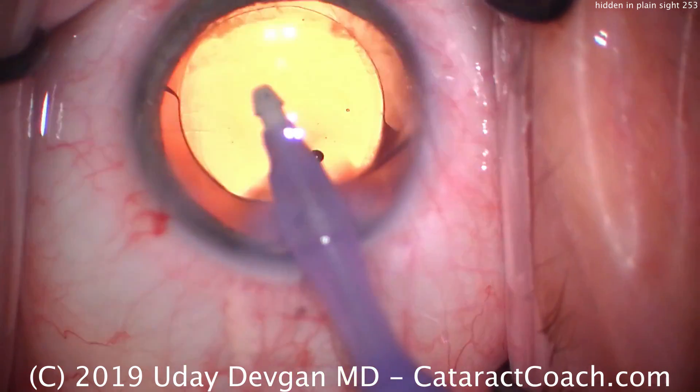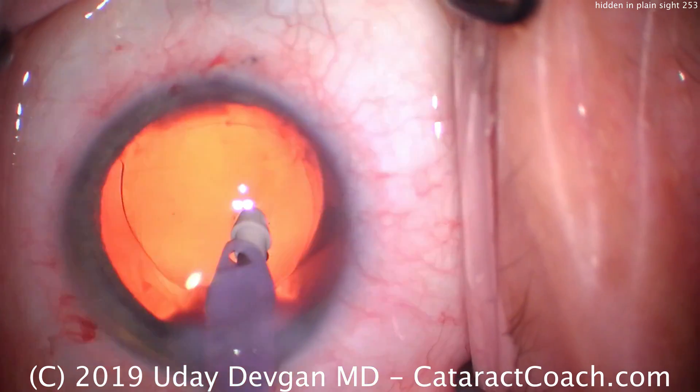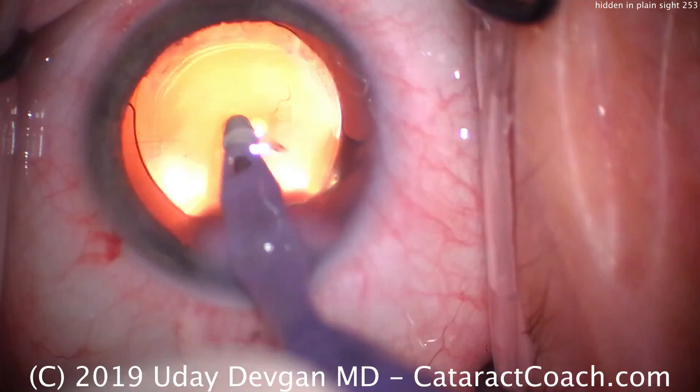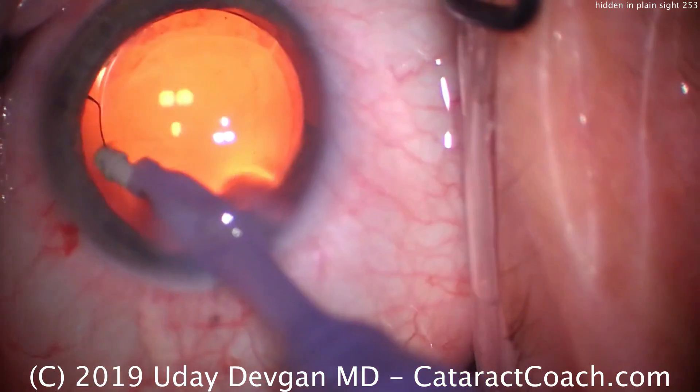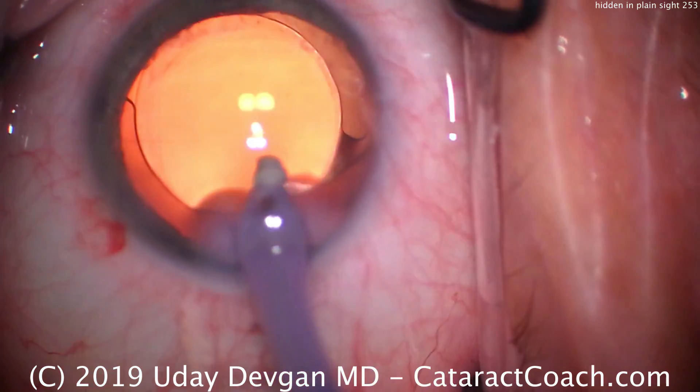The optic is overlapped by the capsorhexis. Moving the eye probe around the eye to remove the viscoelastic. We can see beautiful dilation, beautiful red reflex. Everything looks nice and clean, looks great. What could possibly be the issue here? I don't see anything at all yet.